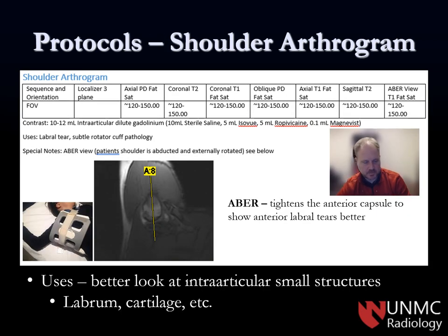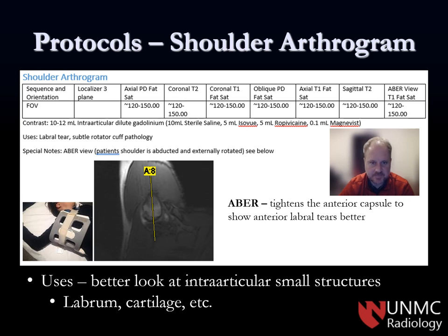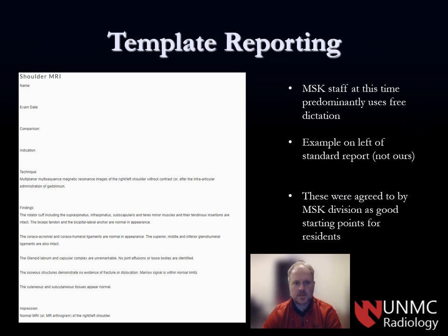Our shoulder arthrogram protocol is used when we inject contrast into the joint to look at certain structures better, especially cartilage and labrum. With gadolinium in the joint, we use T1 fat-saturated images, which show T1 hyperintense contrast in the small joint spaces to detect abnormality. The planes are fairly similar to the non-contrast shoulder MRI. We also always include the ABER view — abduction and external rotation — which tightens the anterior capsule to show anterior labral tears better.